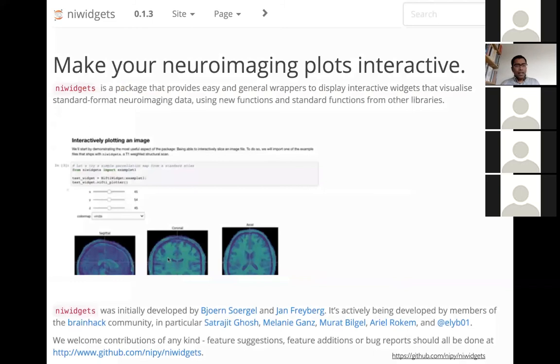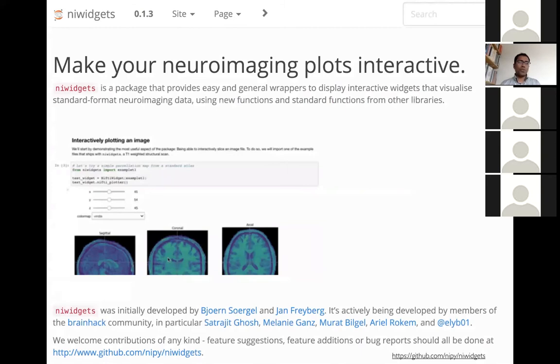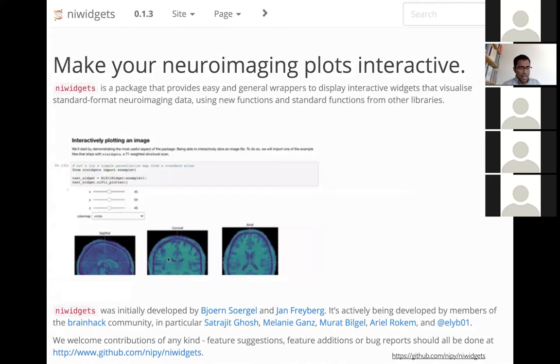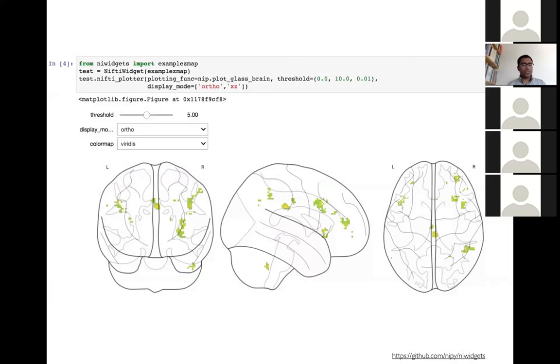Something started by Bjorn Sergel and Jan Freyberg at BrainHack Global last year was to create widgets embeddable in JupyterLab or Jupyter Notebooks for interactive visualization of neuroimaging data. So as you're creating your Jupyter Notebook, you can start visualizing data interactively — very useful for visual quality checks. We did some contributions to this during NeuroHack Week last year. You can do interactive plotting of standard brain images, and also use the Nilearn glass brain to show images interactively within the context of a notebook.